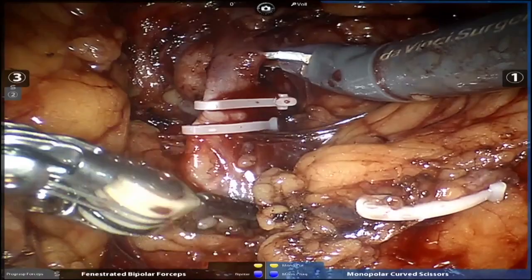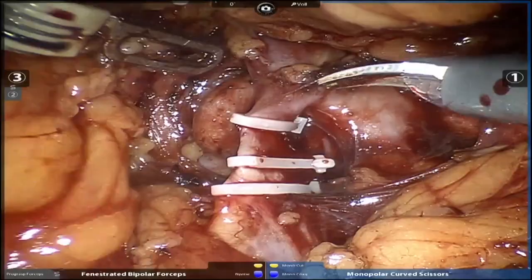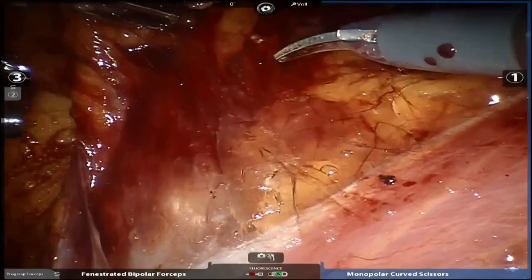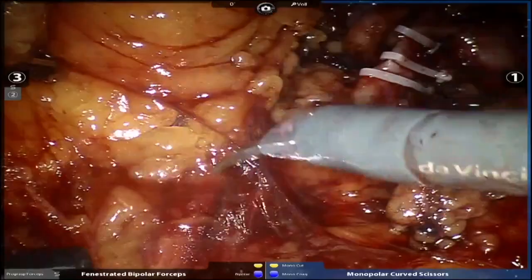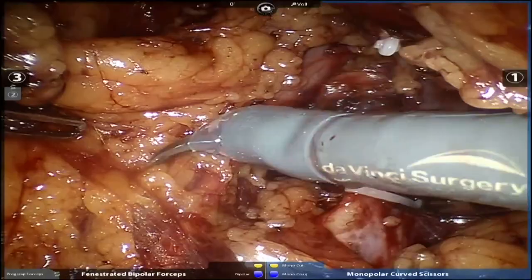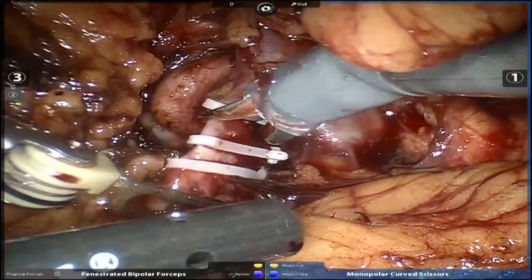But have you seen the gonadal so far? It's up here, I believe. Stop right there. Good, right there, Brando. So, if you remember early on, I'll show you. There's ureter, and the gonadal is right here. So we trace that up. Yeah, but that's a vein to the ureter. Yeah, there's ureter. So I need to take this so I can actually see this vessel a little better.